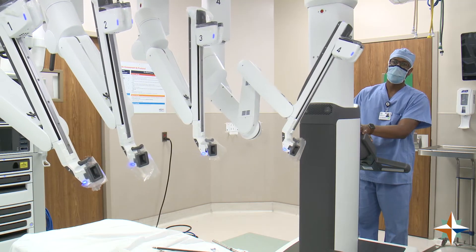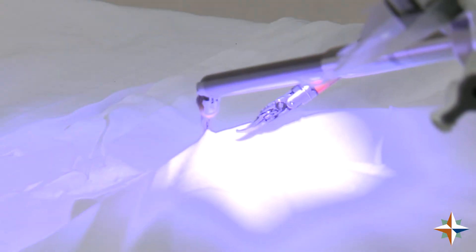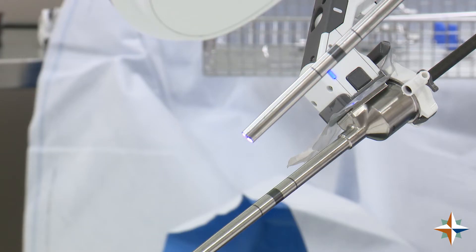The robot has four arms, and we have two consoles. Dr. Dempa and I can work together at the same time in a small space with actual visualization, and the visualization we have is three dimensional. We can trade arms on and off, so Dr. Dempa can do his portion of the procedure in the chest while I'm doing my portion of the surgery, and we work as a collaboration.